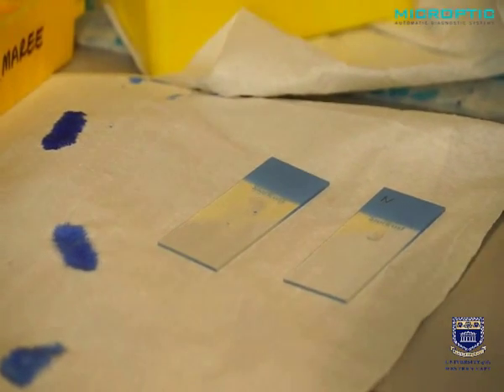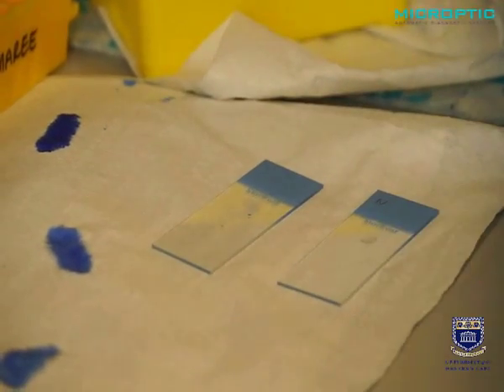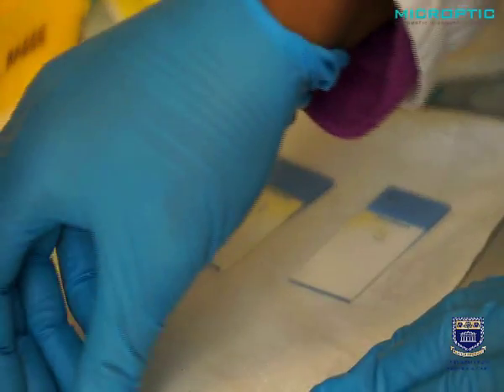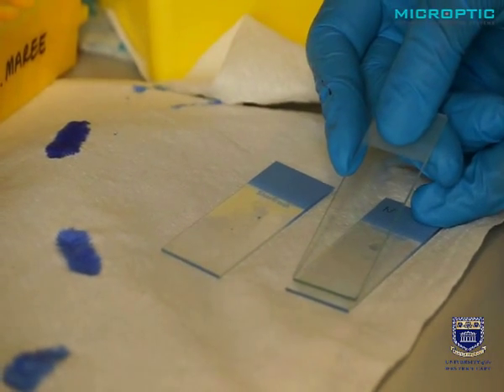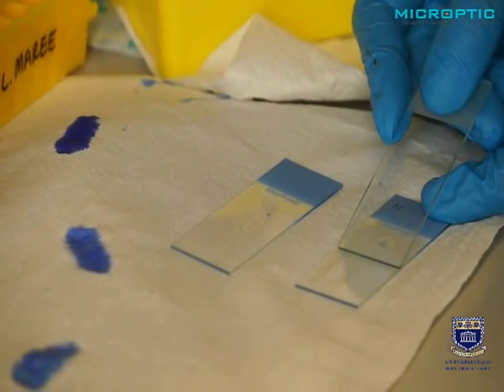And now you can see how she's going to actually make the smear. And this is very crucial, how you make it. She moves the slide in towards the drop. She doesn't touch the drop yet.